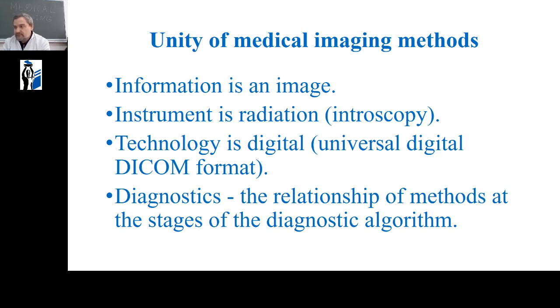The methods of ultrasound diagnostics, radiography, computed tomography, and magnetic resonance imaging are different, but they are based on a visual image.